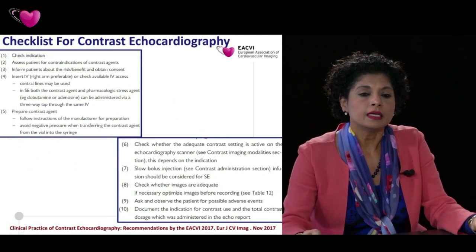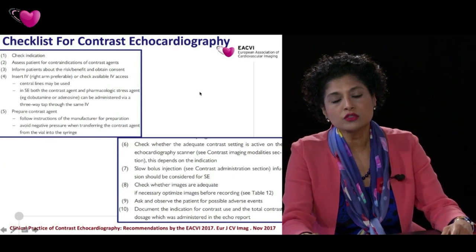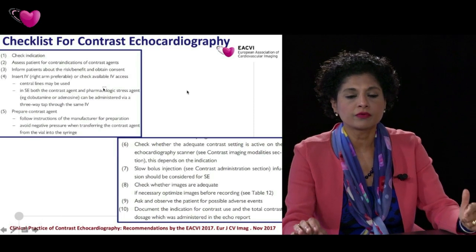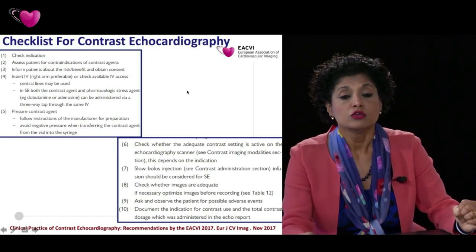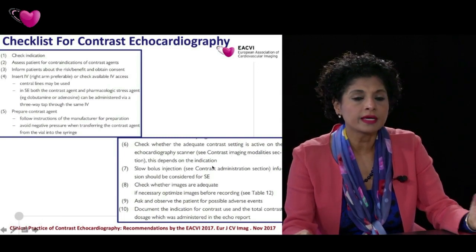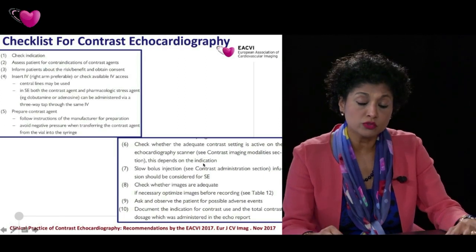Finally, the EACVI paper also provides you a checklist for contrast echo, and I suggest that you follow that checklist, which is really important. You should check for the indication, you should check for correct administration of the contrast, you should check for eventual side effects, if there were any that the patient might have had, and finally also document the indication and the amount of contrast used in your report.